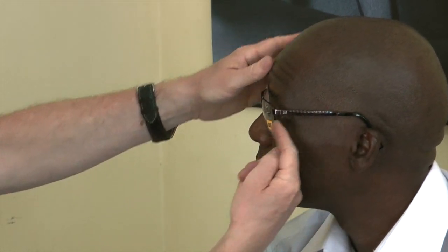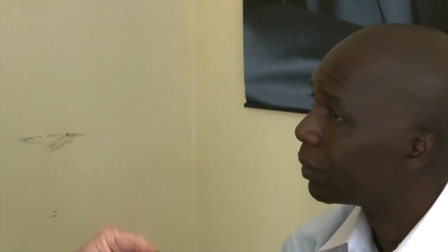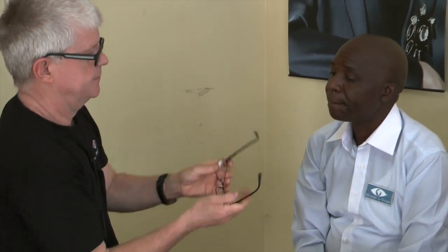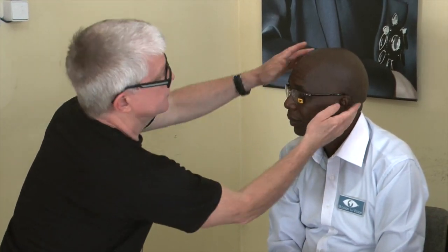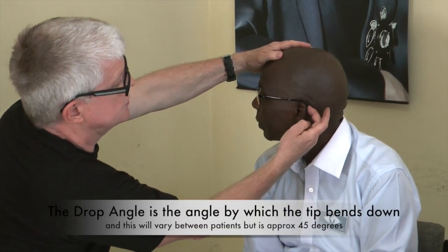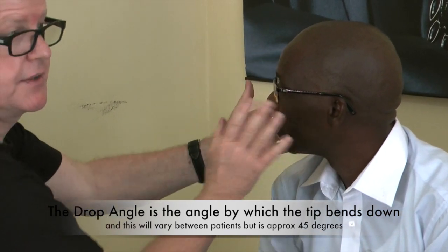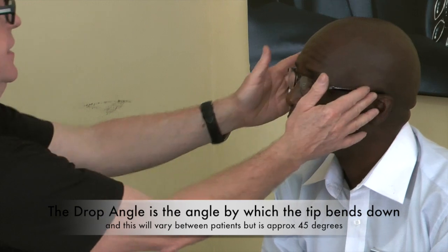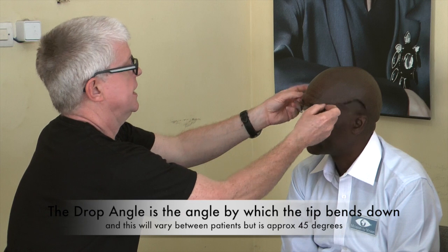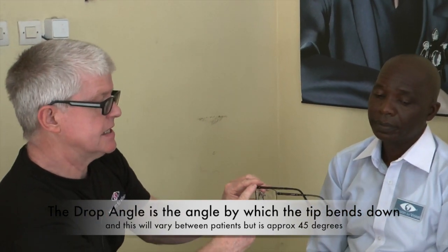That also affects the angle of the front. So it's very important that we make that adjustment correctly. You do it so that it's sitting flat, it's not too tight, and the glasses won't slip forward — so that's a comfortable fit. Obviously you do the same for both sides, and then the patient will be very happy with the fitting of the frame. So that is length to bend.